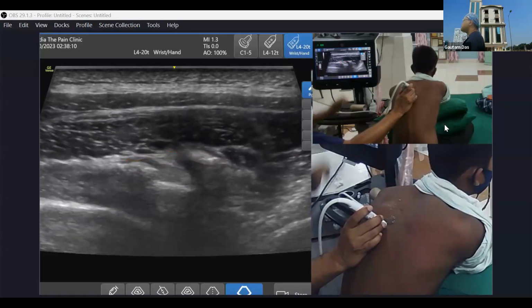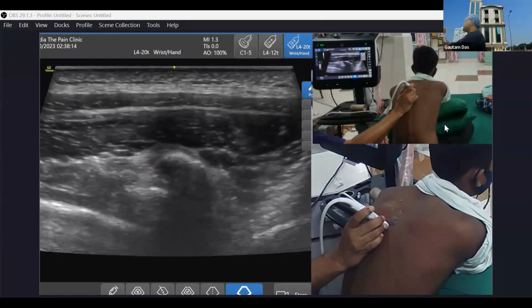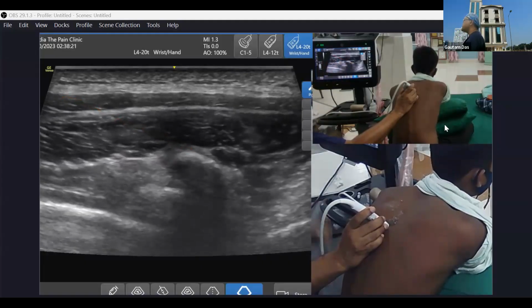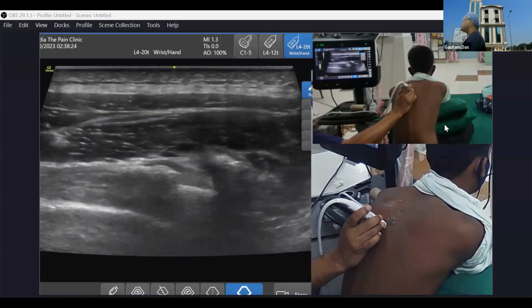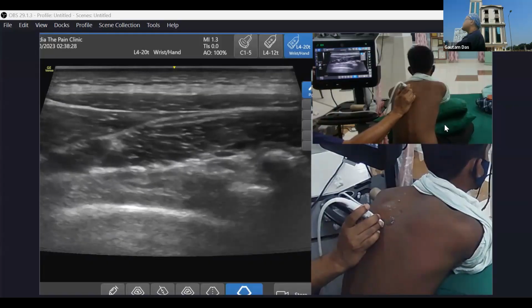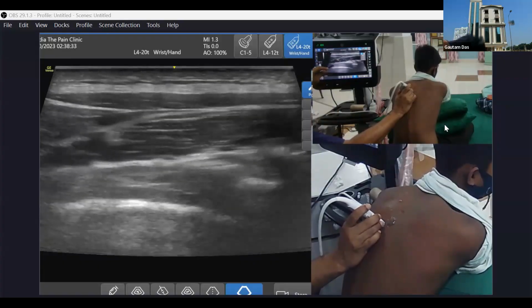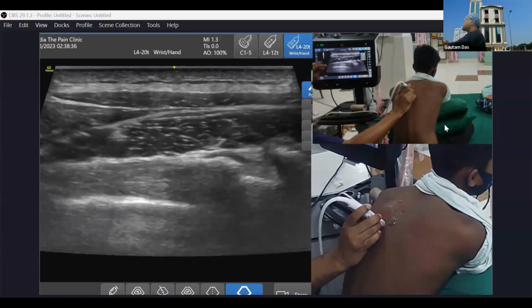So in this position, if you wish to give the erector spinae block, your needle can come like this and give the injection, or you can give it in the long axis also. Long axis I'll be showing. So this was the muscles as I was telling, below the iliocostalis. Lateral to the iliocostalis is your longissimus. So this is your iliocostalis, lateral most.